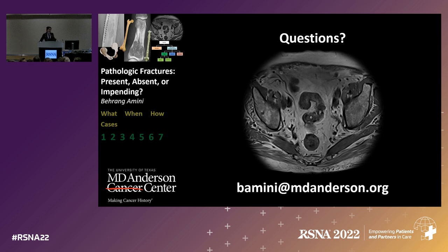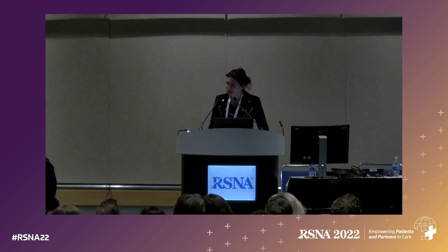While people are coming up with these questions, I do have a question for Dr. Yablon because this comes up in our practice a fair amount. What do you do with that patient that comes in with a toe ulcer that has edema in the toe, but not the confluent decreased T1 for clear osteo? They got just a little bit of edema, maybe a little bit of reticular T1. How do you manage those cases with those sort of borderline findings in your practice?